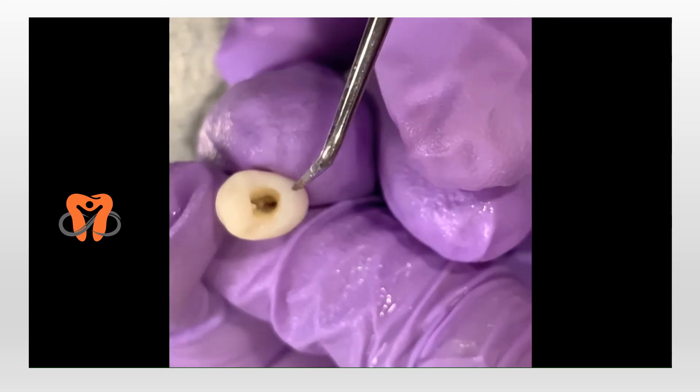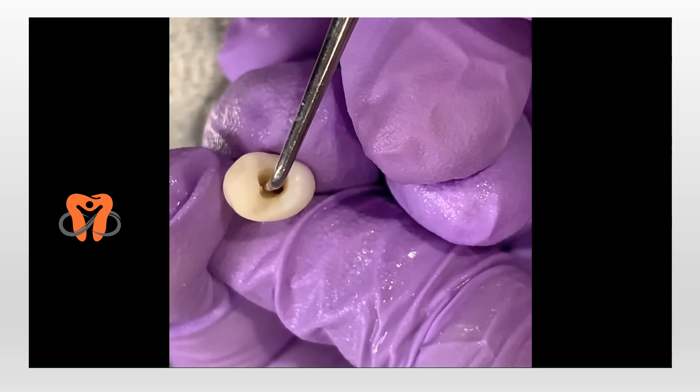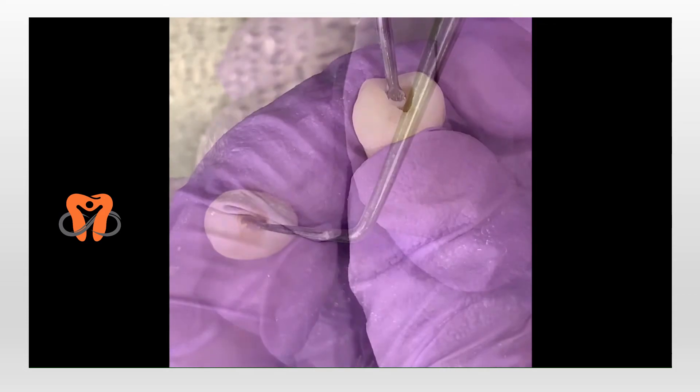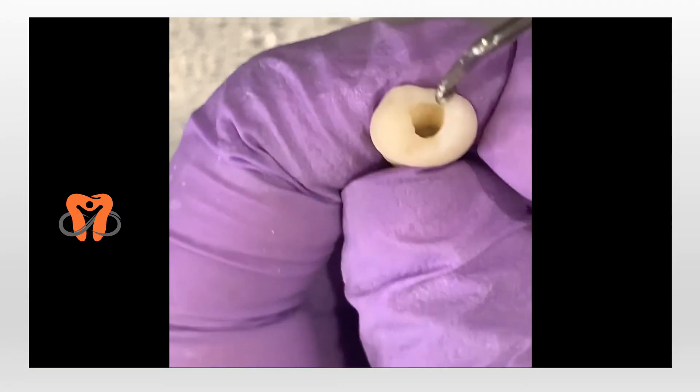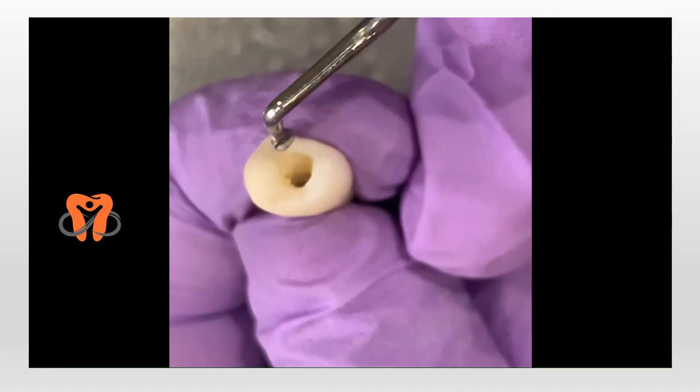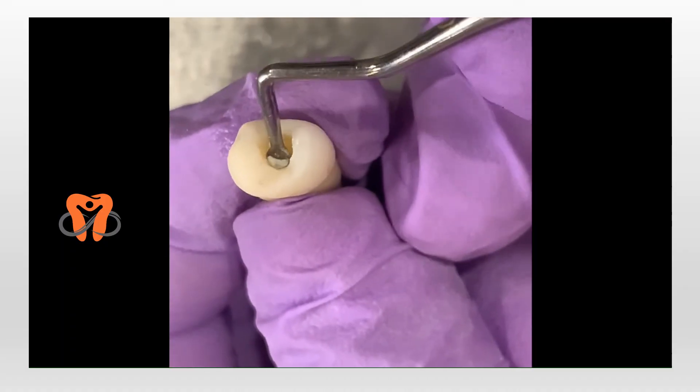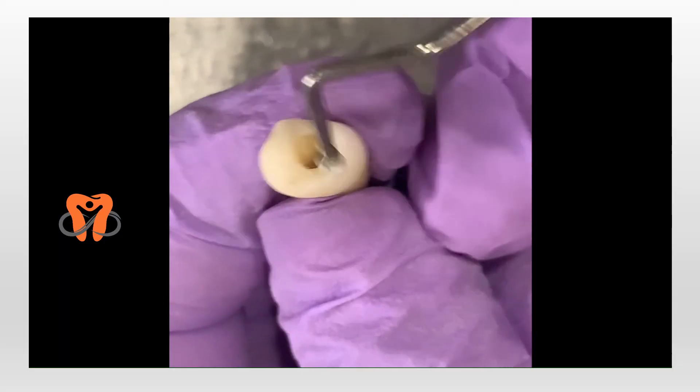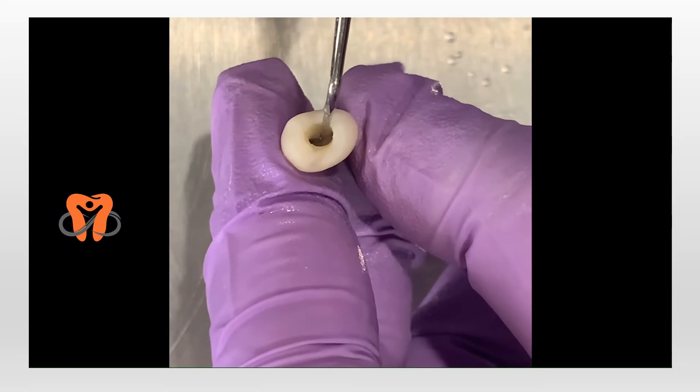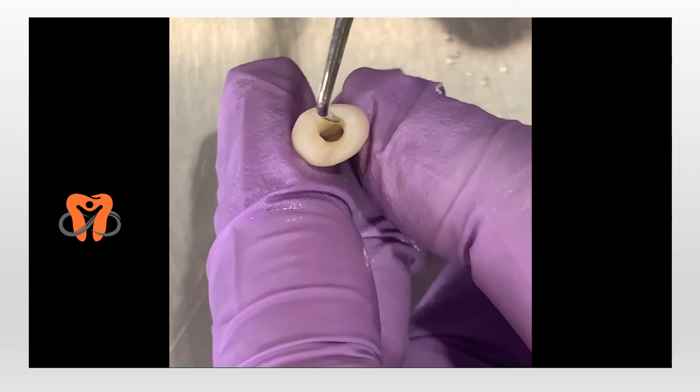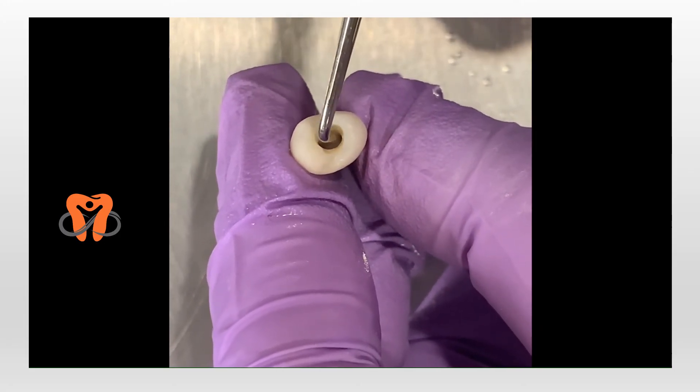Now with help of an endodontic explorer and then an excavator, any debris that is present is removed along with pulp remnants or overhangs of the roof of the pulp chamber so that we can achieve direct access into the pulp chamber. You can see this is the buccal orifice and this is the lingual orifice.